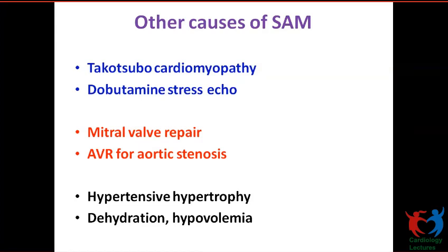In mitral valve prolapse, the basal hypercontractility which is seen is the answer which was given, ma'am. You also read about the ballerina effect and all that, the ballerina movement. That is the reason why they get that configuration. Because of the eccentric hypertrophy, in LV angiogram you get a ballerina foot deformity.